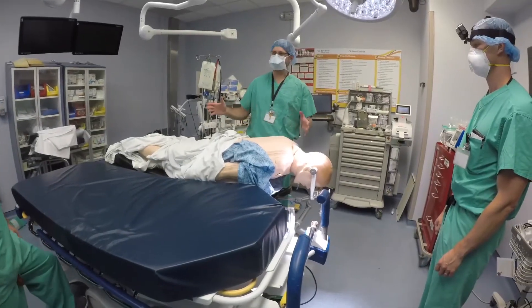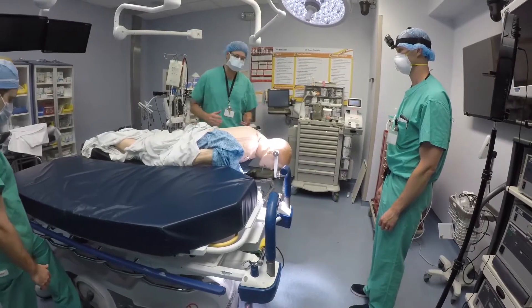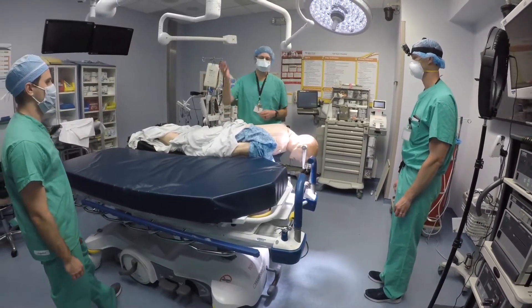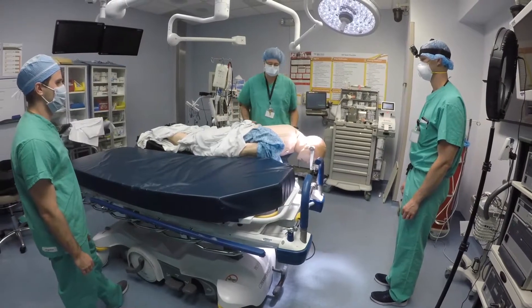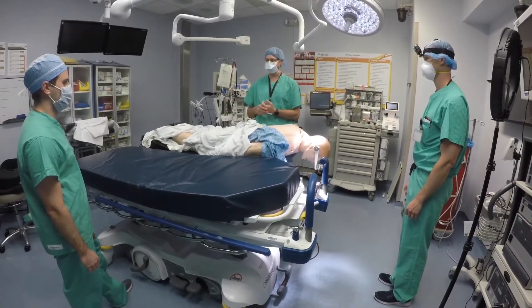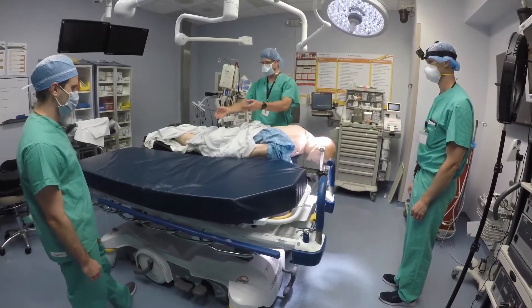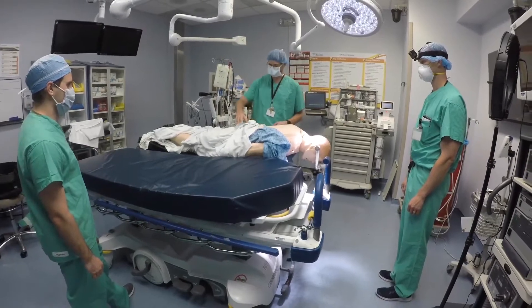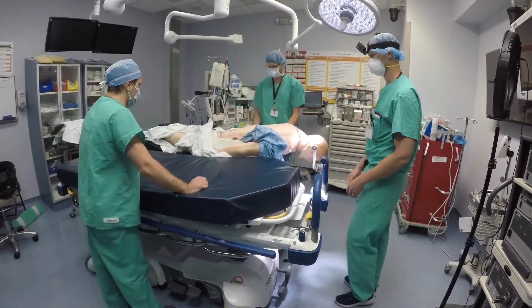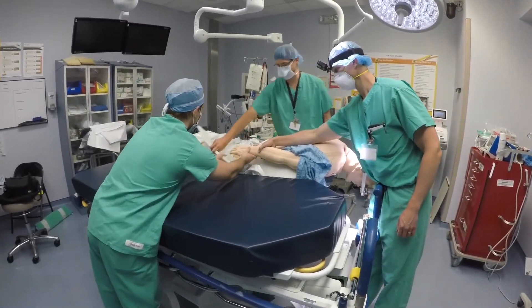There's a point in time when everybody's unscrubbed, and the last thing anyone wants is to be caught over on the side of the operating room not helping. The bed needs to be brought in when you're getting ready to flip the patient back over — that's a really helpful thing medical students can do: run out and grab the bed and bring it in. You grab the bed, release the sheets and tape, somebody holds this arm, and then somebody else has to catch as you flip.